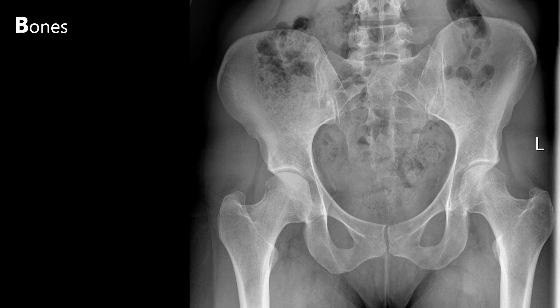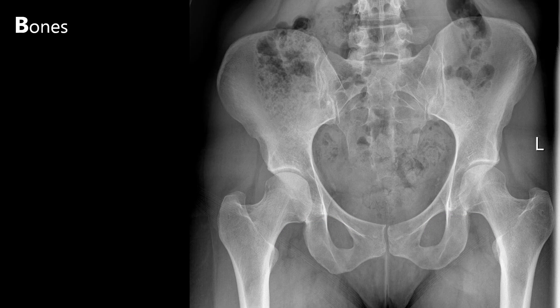There are three sets of lines that we should also assess here. The pelvic brim should be smooth and roughly circular. The two obturator foramina should also have a smooth outline and be roughly symmetrical. The final line to assess is Shenton's line, which can be found bilaterally, following the medial edge of the femoral neck and inferior side of the superior pubic rami. Any asymmetry in the structure of these bones, discontinuations in their cortex or disruption of these lines could be the result of a fracture.